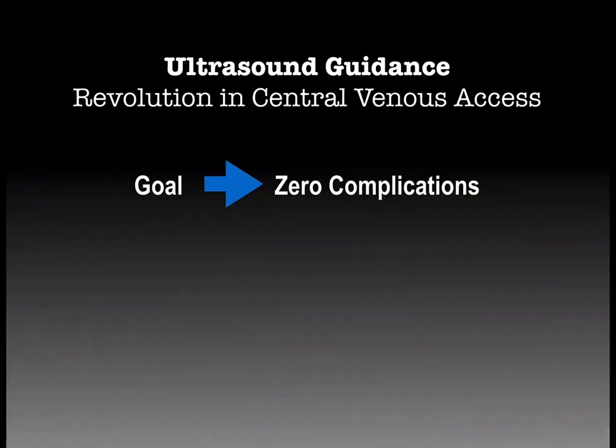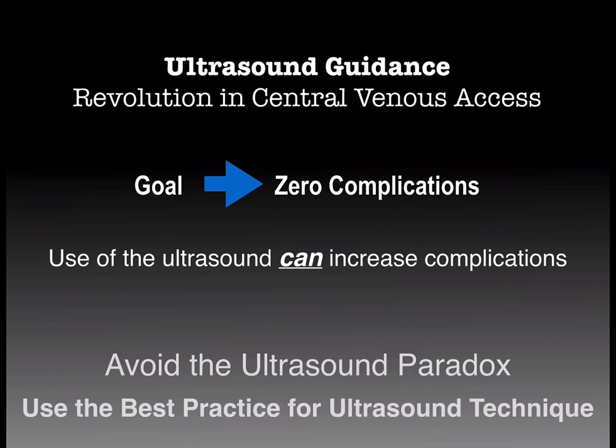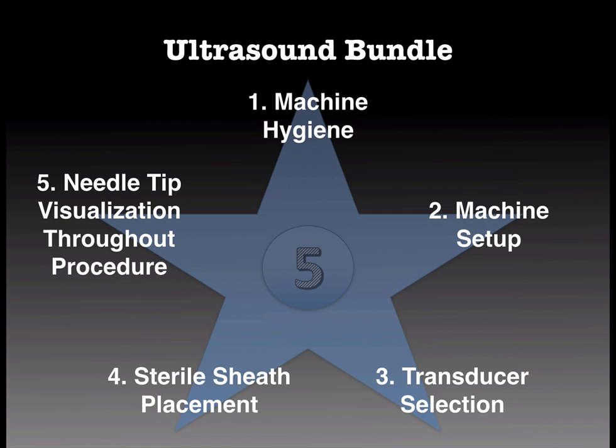However, even though our goal is zero complications from central lines using ultrasound, if we don't know how to use the ultrasound properly, we can actually have an increase in our complications from central lines, because we think we know what we're looking at and we're looking at something completely different, and then we cause the patient harm. So patients are always the first priority, and so we want to make sure that we are doing the appropriate, most up-to-date technique with our ultrasound as well as needle placement.